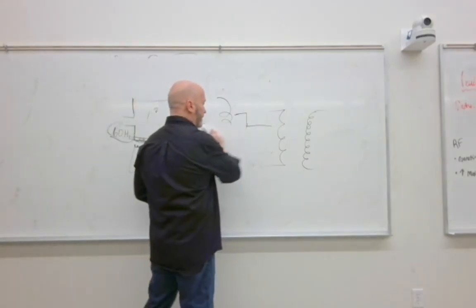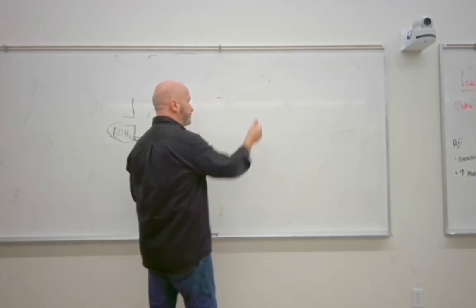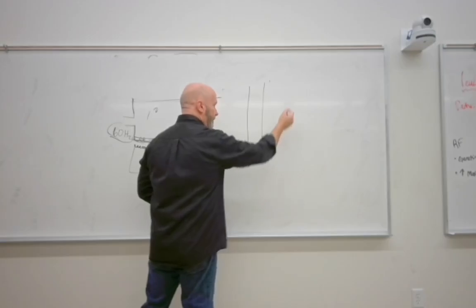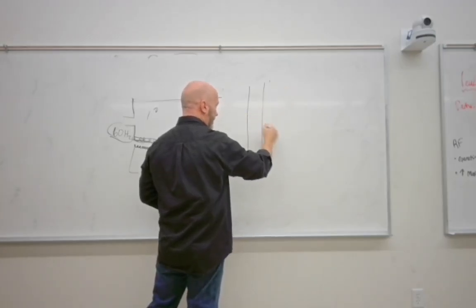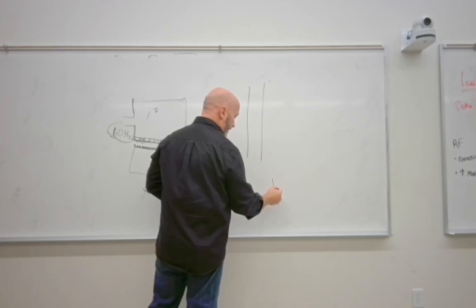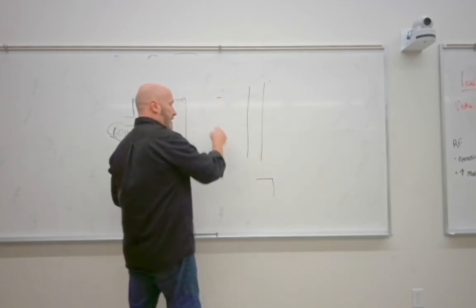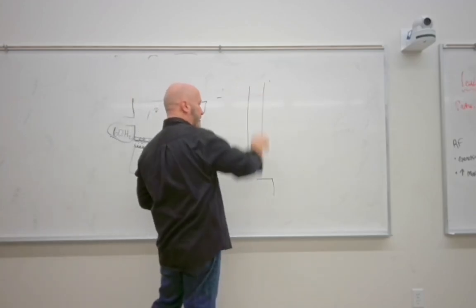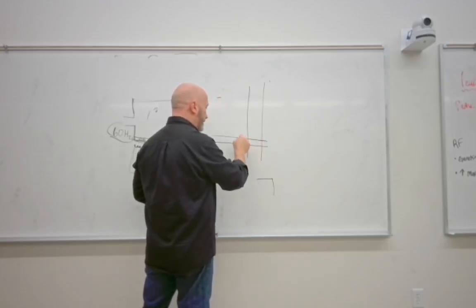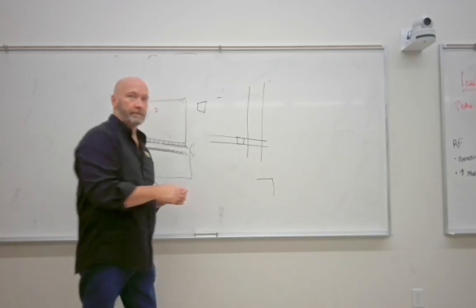One set of rails is stationary, and they go the length of the room. Right? So they go all the way from one end of the room. In our lab, you've got this dead space over here. The X-ray table is here. You've got that space over there, and then the door is right here. And then the sink is over here, right? So you've got one set of rails that goes all the way across the room, and then a secondary set of rails that ride on that. And then the tower, the X-ray tube, and all that apparatus ride on this one.